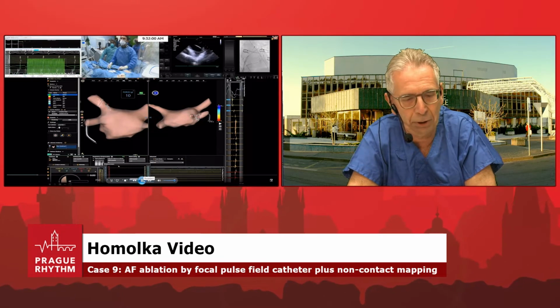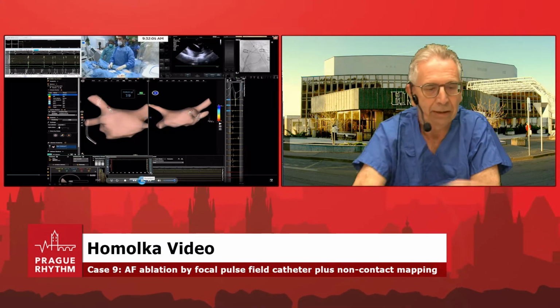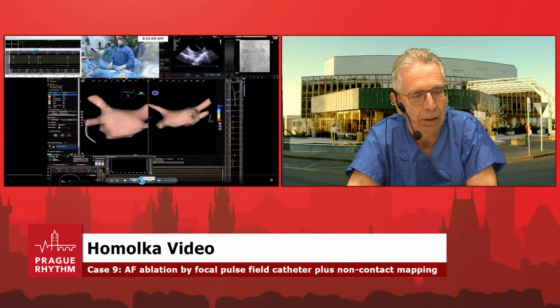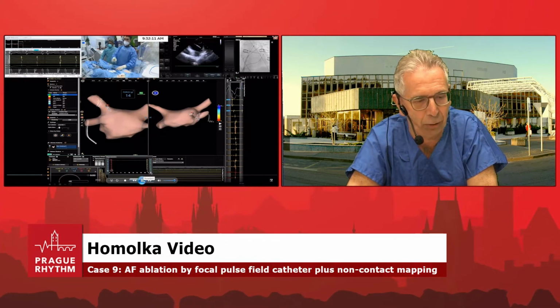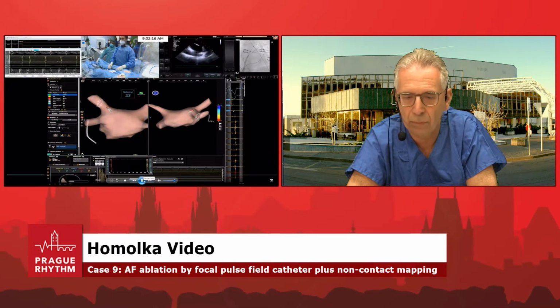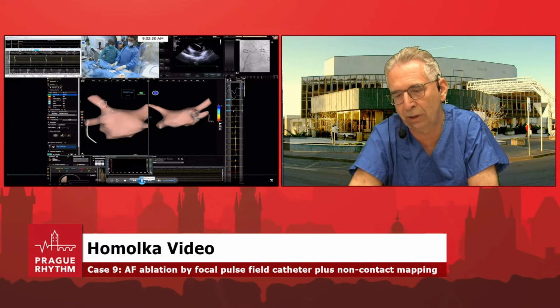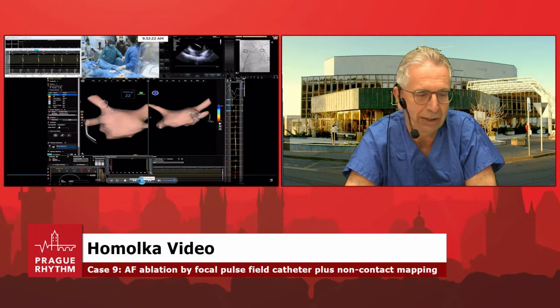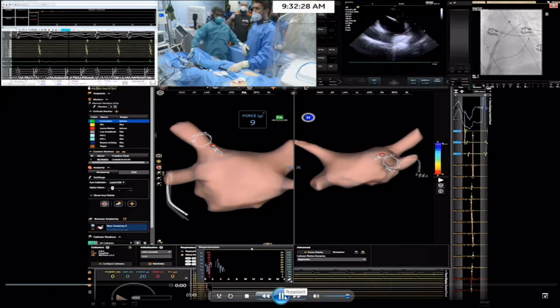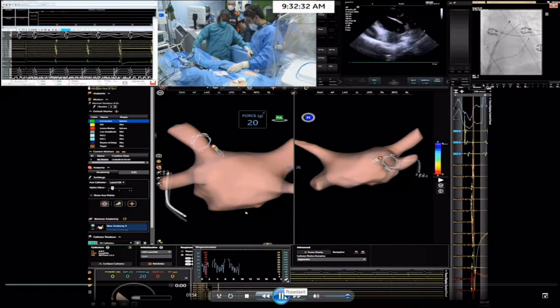So you will appreciate that he's going from the left side. And still, you can see on the Pruka, the left top, we are pacing from CS. So the CS catheter is introduced. And on the top right, you see the fluoro with the lasso catheter in the left upper, and the contact force catheter in the central part of the screen.